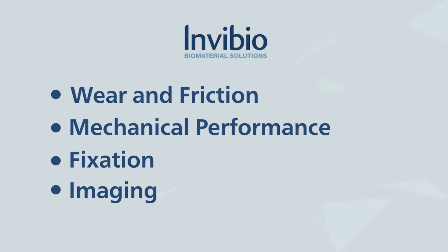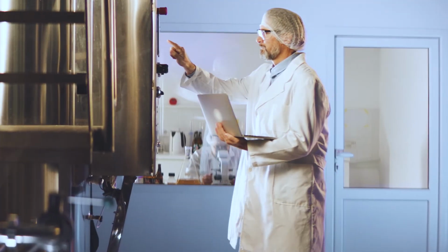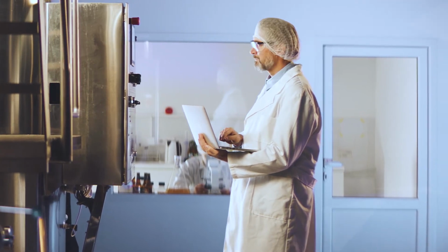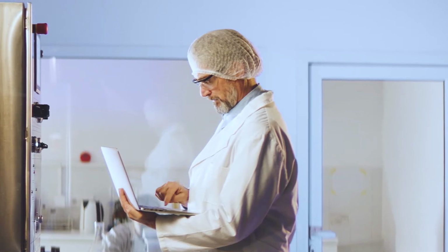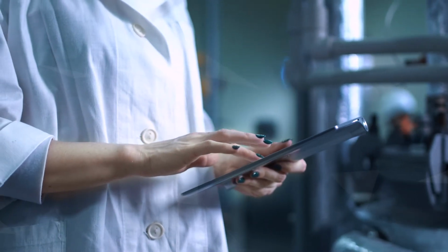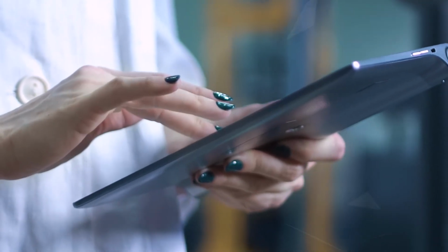When we look at things like wear, we tend to be placing the components into mechanical simulators and measuring the amount of wear that's produced during a walking cycle for the equivalent of 10 years worth of typical use. When we look at the mechanical aspects, we would perhaps look at the typical amount of load that is taken by the component during a cycle and replicate that over a number of iterations.